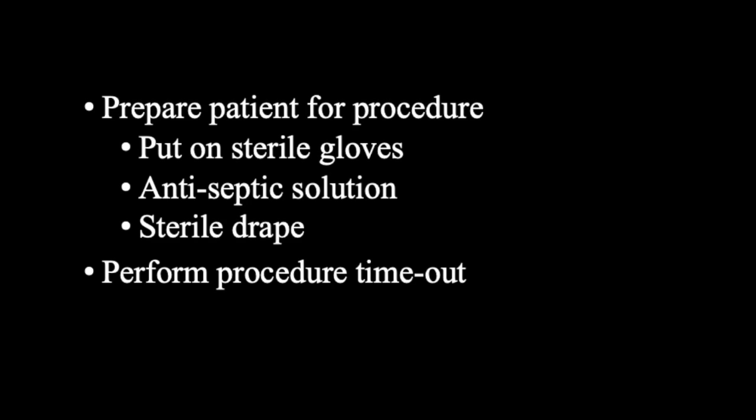Prepare the patient for the procedure by opening the spinal anesthesia tray. Sterile gloves should be put on, and the patient should be prepared with an antiseptic solution. The solution must remain in contact with the skin for at least 1 minute to be effective, and the dry residue can be wiped away with sterile gauze. Maintain aseptic technique and apply the sterile drape to the back.